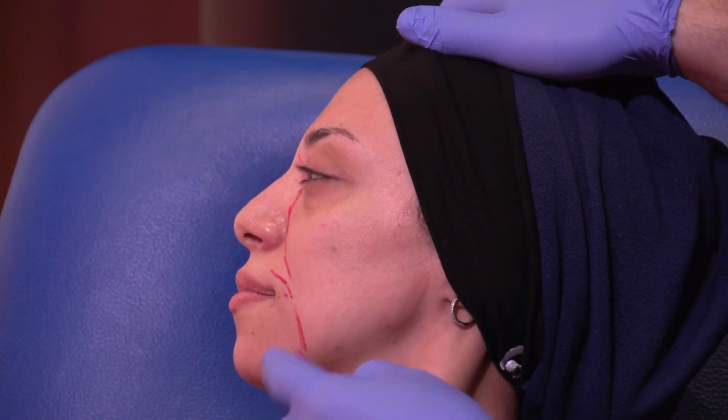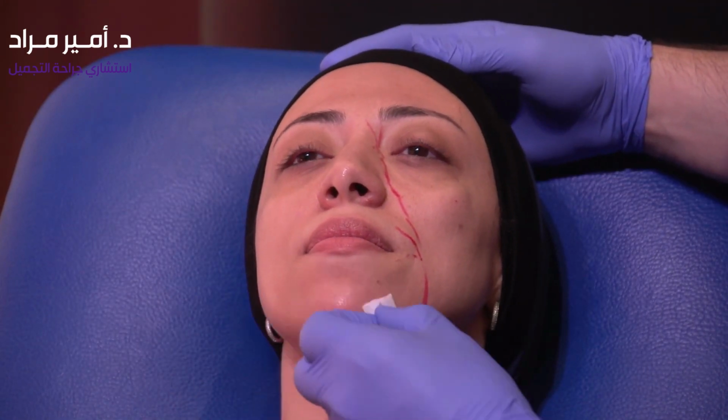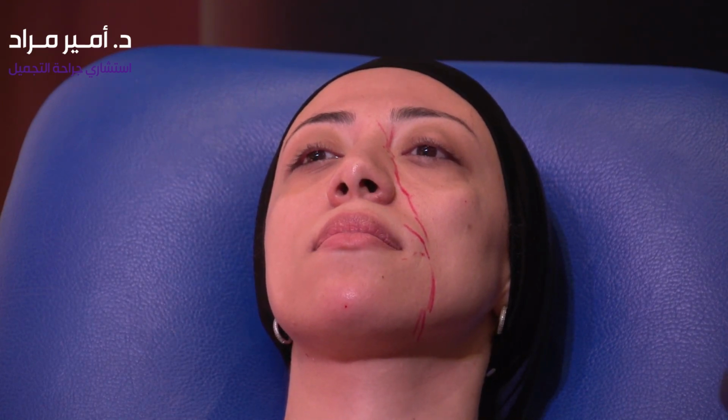Yes, some contouring. She was much more receding, and I said that before treating, she would need another injection, 2 to 3 minimum. So let's have another needle. I'll do that faster. How are we doing with time? Very good. Good? Okay. Good.